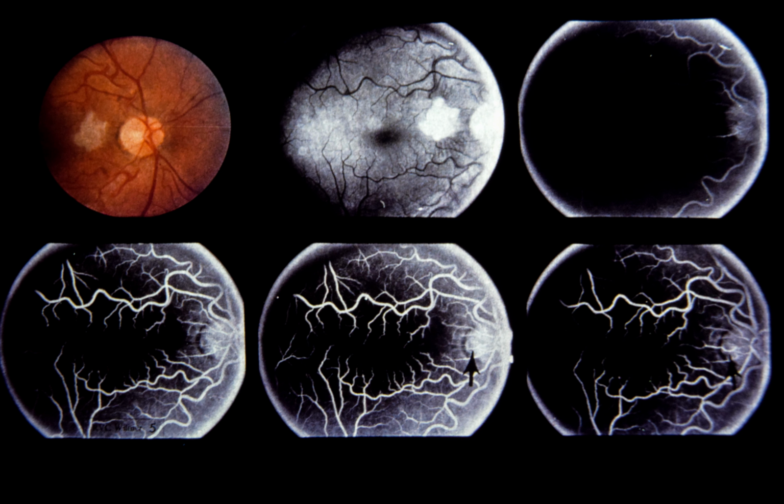Upper right, note normal filling of retinal arterioles 10 seconds after dye injection. Lower left, 25 seconds after injection, note filling of all retinal vessels except for capillaries in papillomacular bundle. Lower center, 30 seconds after injection, note first appearance of dye in obstructed cilio-retinal artery.